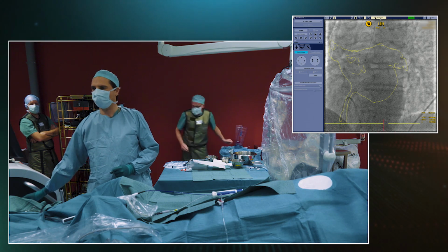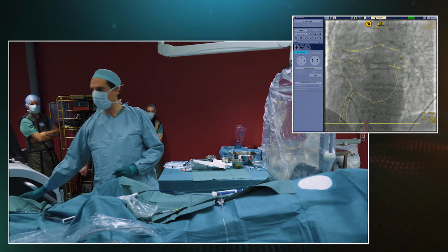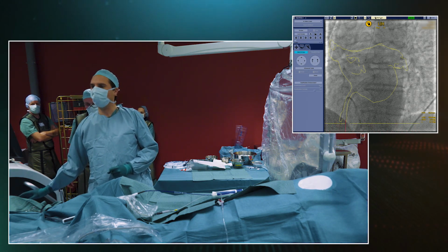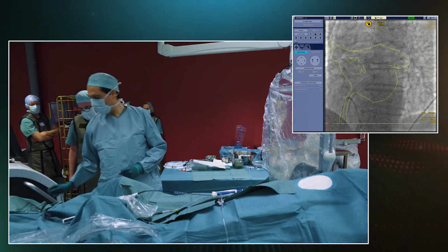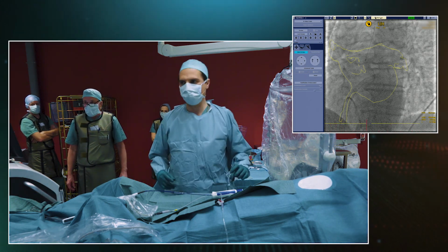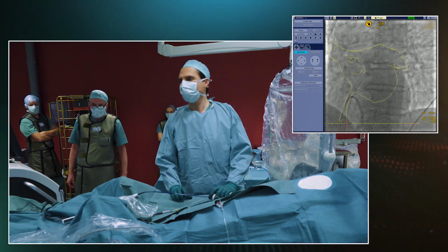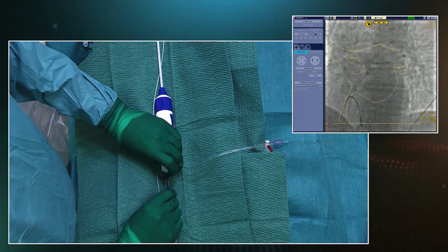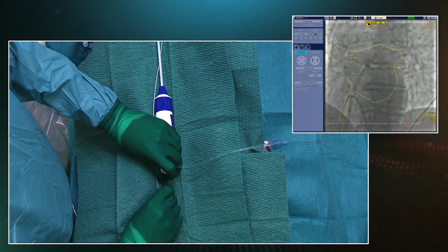You can see that this nice man has a common ostium on the left. That's typically not a problem at all, provided you appreciate it, provided you understand the anatomy. It's not a problem at all to occlude this with the balloon. What we're going to do firstly is gently advance the balloon. Here you can see it coming out of the sheath right now.